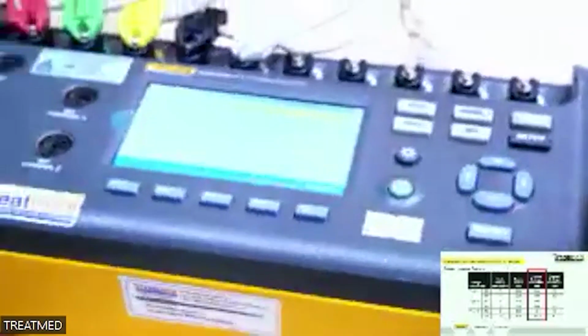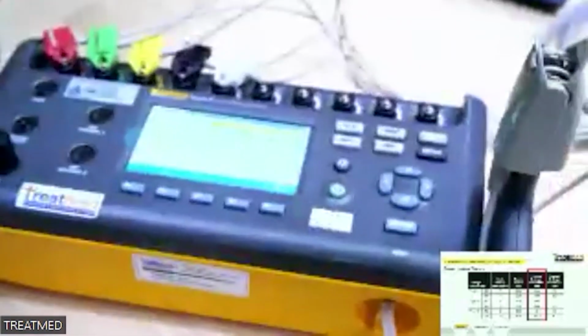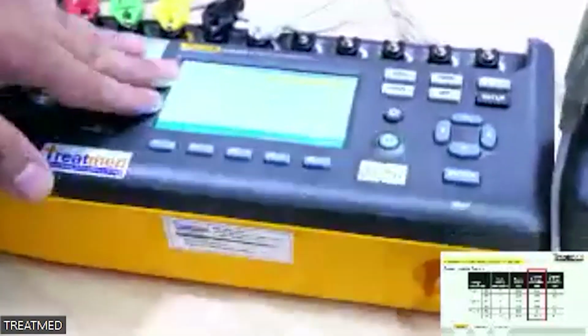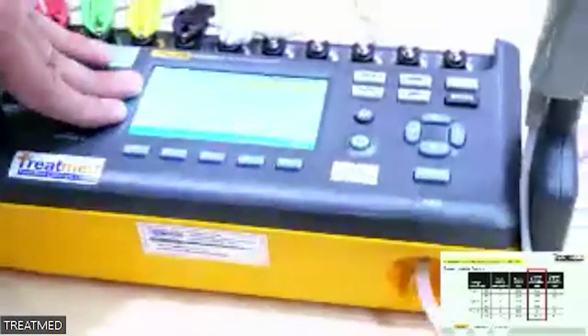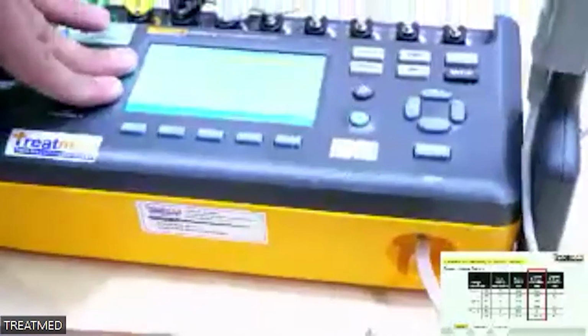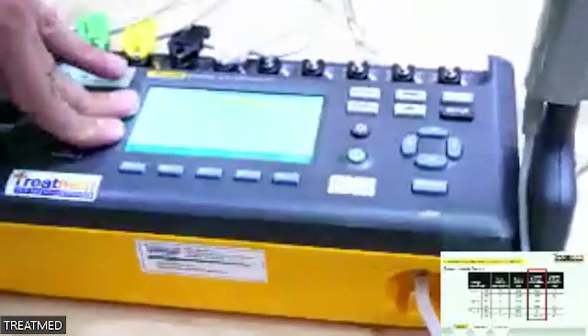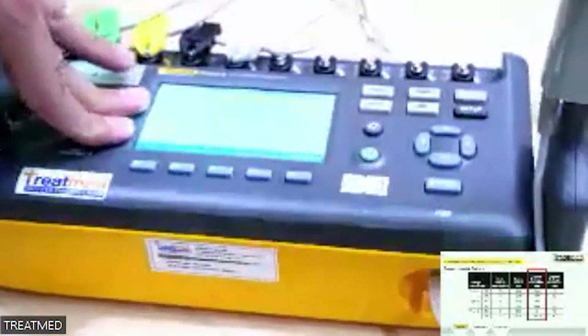But for the static pressure, we must first enter the service mode of the patient monitor because when we test this, it can leak a lot since the solenoid valve in the patient monitor is always open. We must enter the service mode to close the solenoid valve first.